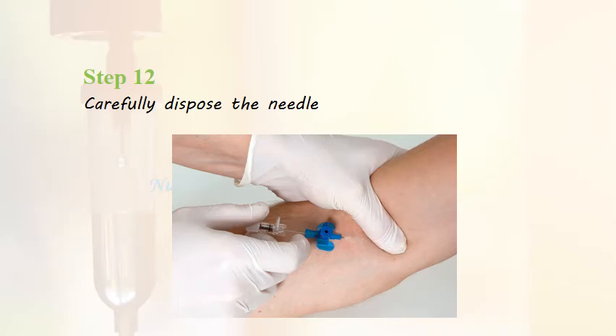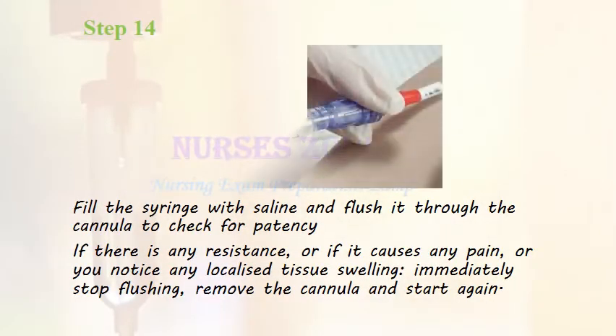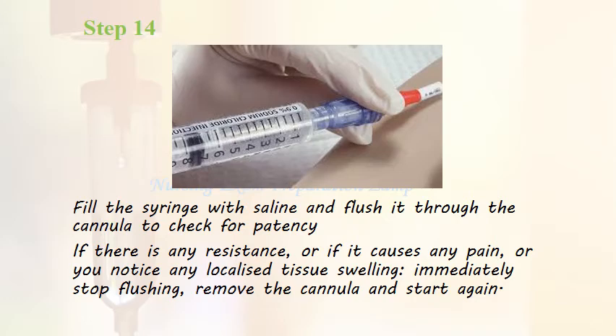Step 12: Carefully dispose of the needle. Step 13: Apply the dressing to the cannula to fix it in place and ensure the date sticker has been completed and applied. Step 14: Fill the syringe with saline and flush it through the cannula to check for patency. Step 15: If there is any resistance, pain, or localized tissue swelling, immediately stop flushing, remove the cannula, and repeat the procedure in another suitable vein.